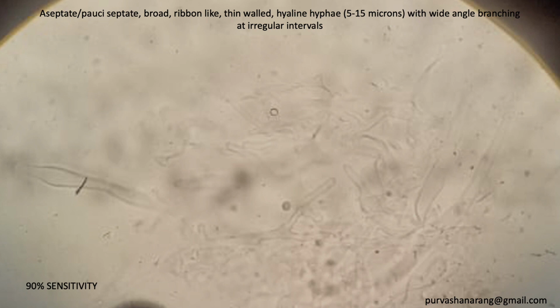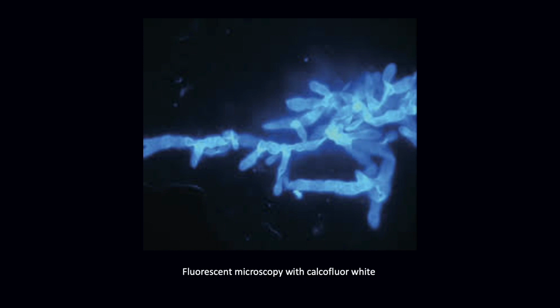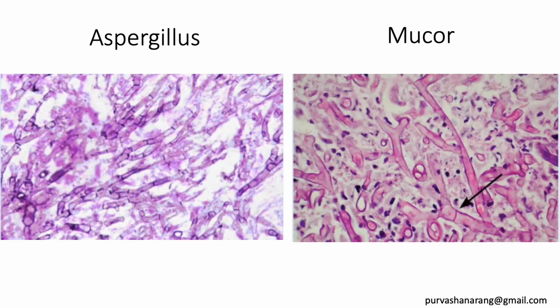One may enhance its detection by adding calcofluor white and observing under fluorescent microscope if available. Sample may also be sent on another slide for gram stain. If microscope is unavailable, then sample can be sent in sterile normal saline. A gram stain slide is screened by 40 times magnification and visualized under oil immersion and 100x magnification too. It may show similar features, and this helps us to differentiate between mucor and aspergillus, as both are angio-invasive fungi. As seen here, aspergillus has thinner hyphae, regular septations, and acute angle branching.